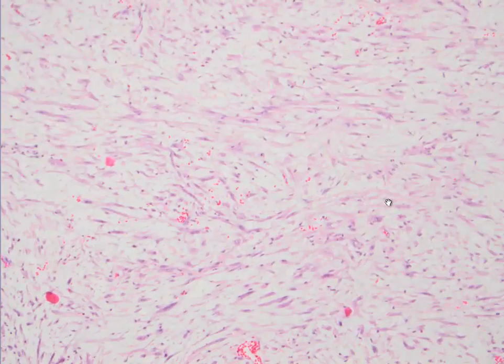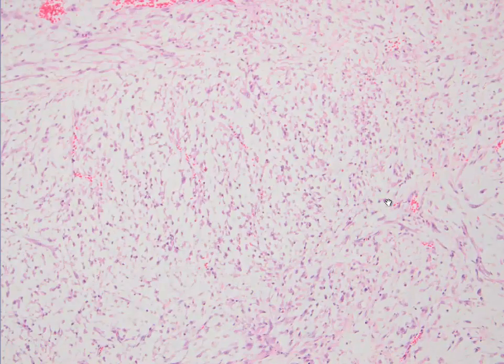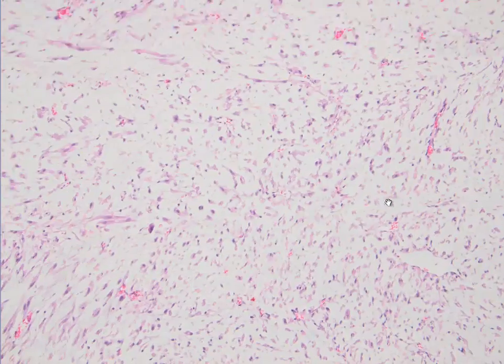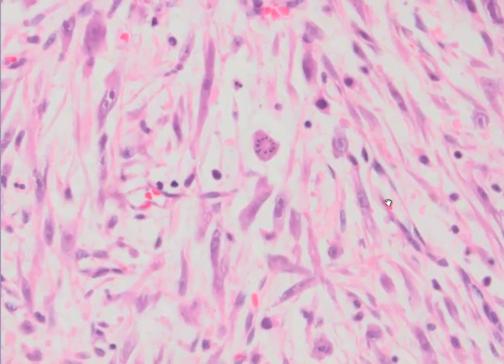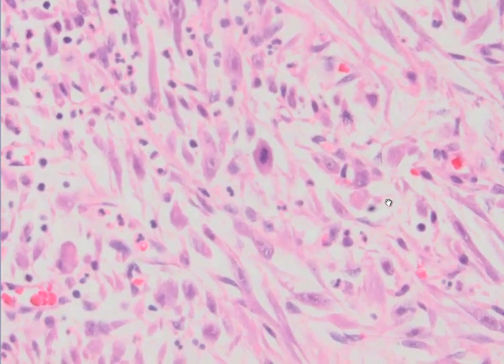And another thing is, although this is a spindle cell proliferation, this is a little bit less cellular and more edematous compared to the sarcomatoid carcinoma of bladder. And when we come here, we see some mitotic figures, and this is a quite nice one, like a sun or ring, or here another mitotic figure.